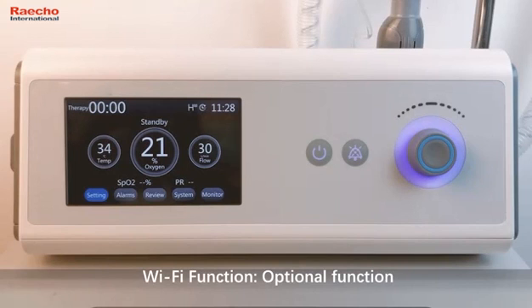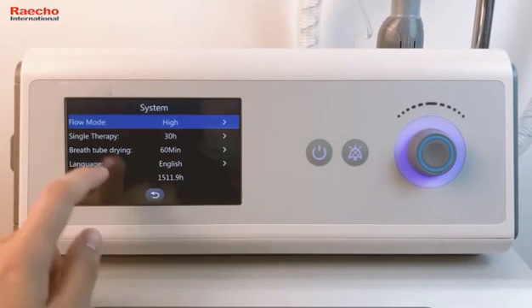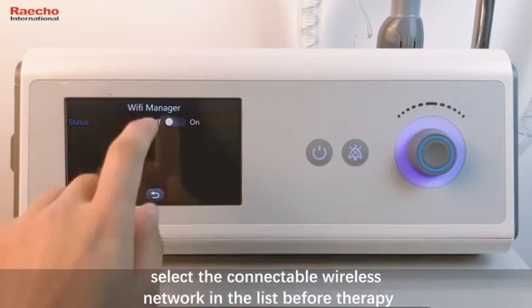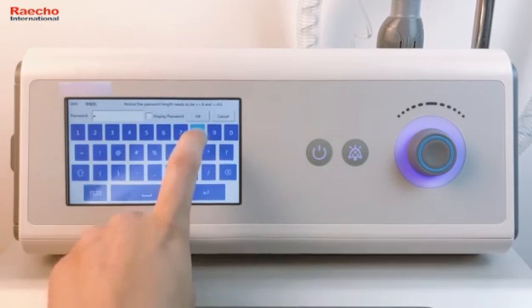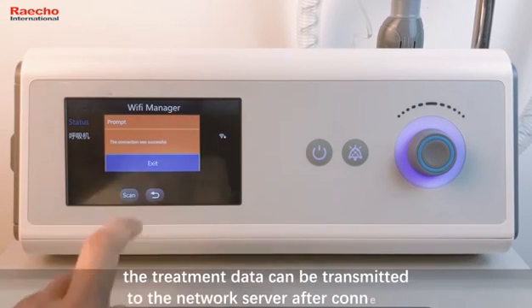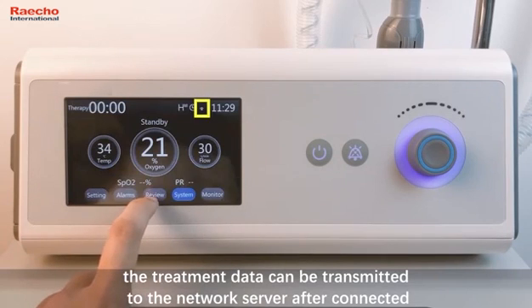Wi-Fi function, optional function. Select the connectable wireless network in the list before therapy. The treatment data can be transmitted to the network server after connected.